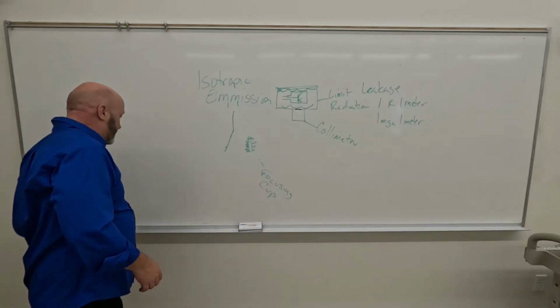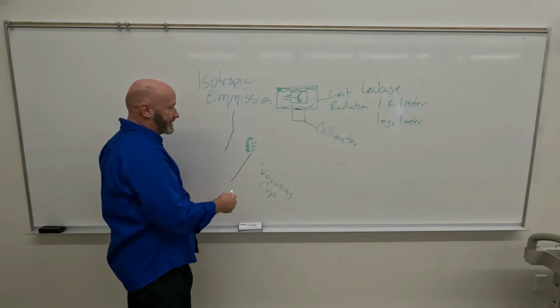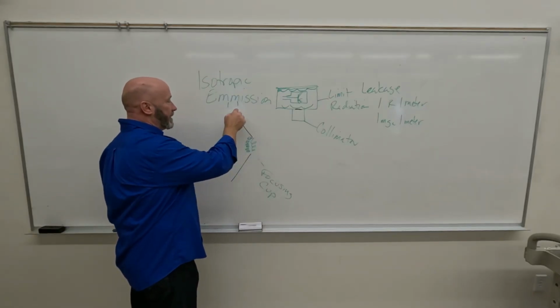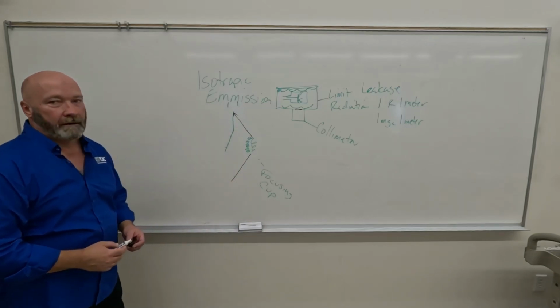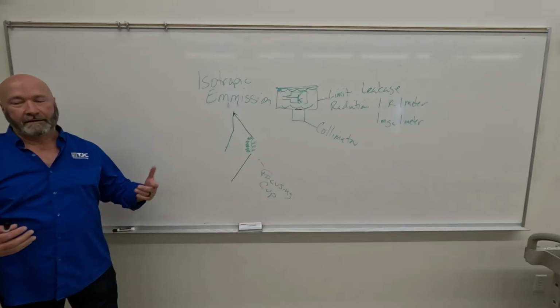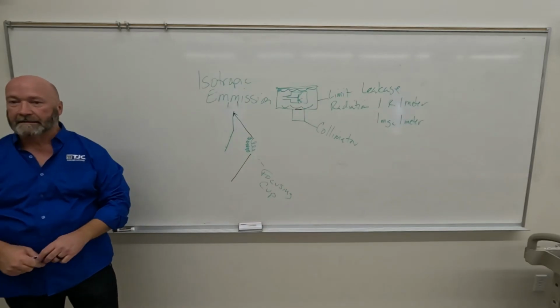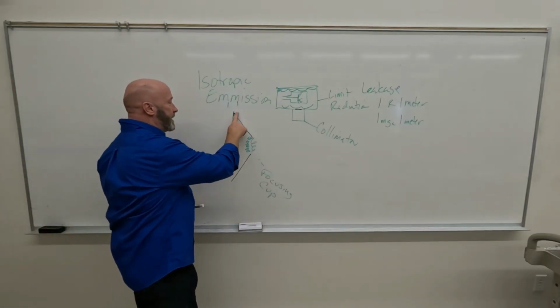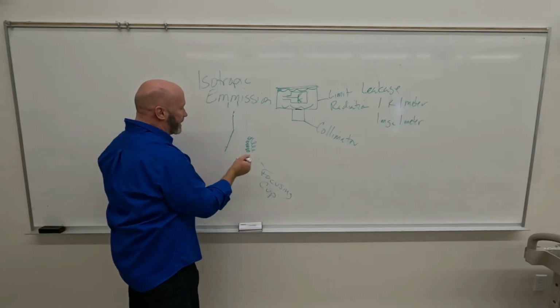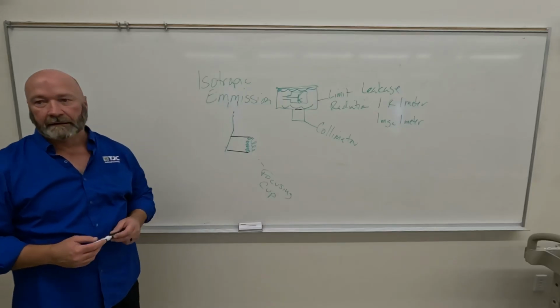So again, if we send the electrons across the tube, some of those are going to go down to the glass, and that's going to be disastrous for the X-ray tube, as we're going to talk about in a bit. But some of them are going to go up there. And then we get isotropic emissions, and what we have is basically a fluorescent X-ray tube. Those lights, right? But if we can confine them to just a small area of impact on the anode, then we can improve our sharpness of recorded detail.